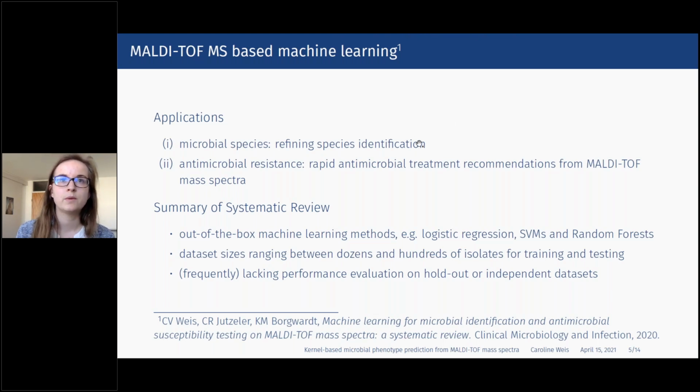So what we could conclude with that is that MALDI-TOF based machine learning research is really in its infancy, and while gaining popularity and more papers are coming out, no significant strides in terms of machine learning research have been taken yet in the field. Just coming from the field of machine learning in computational biology and healthcare is actually quite disappointing, because machine learning healthcare has been getting so much attention lately, and the field is really soaring. And whenever I present my project at machine learning conferences, the topic is met with huge interest.